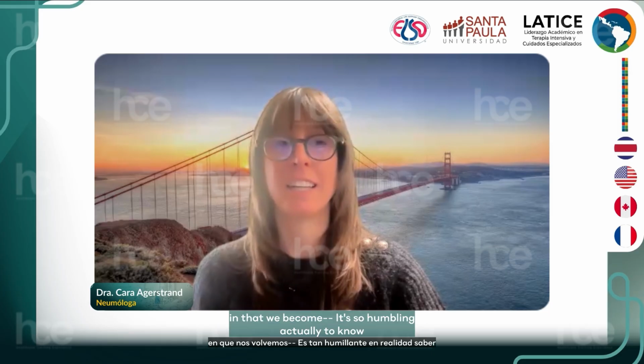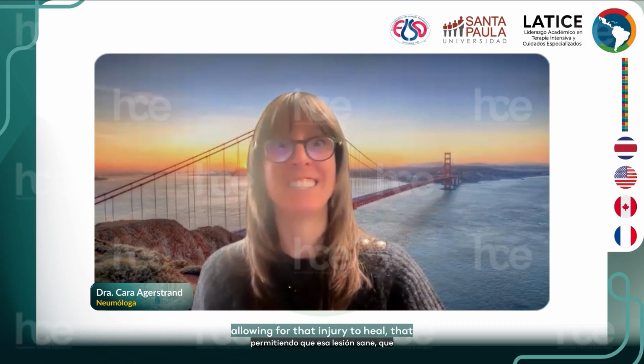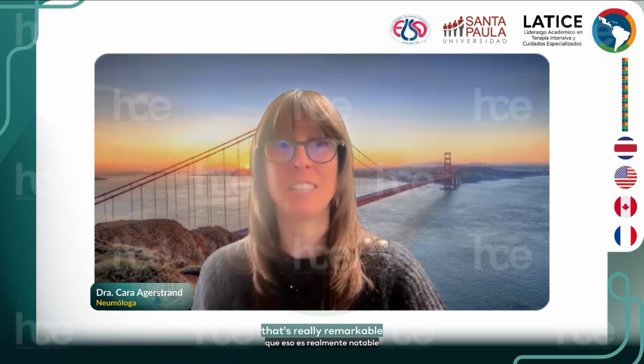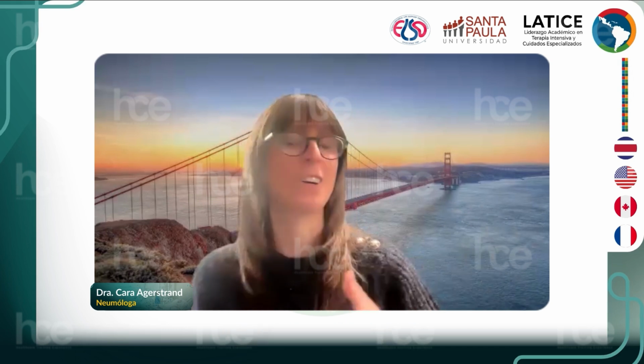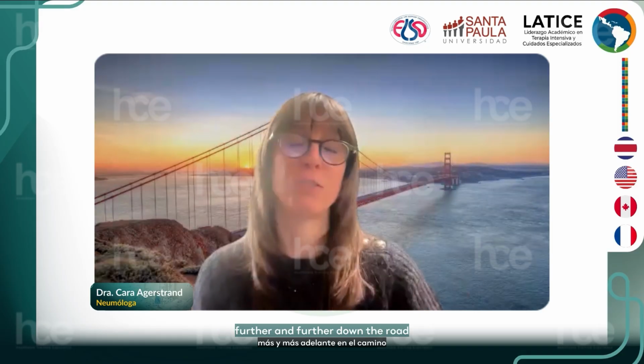I totally agree with Mathieu in that it's so humbling to know that if we support that patient long enough, allowing for that injury to heal, they can do quite well. And I think that's really remarkable. And as ECMO has become safer and more complication-free, and we can support patients for longer, we've really been able to push that duration of how long is too long further and further down the road.